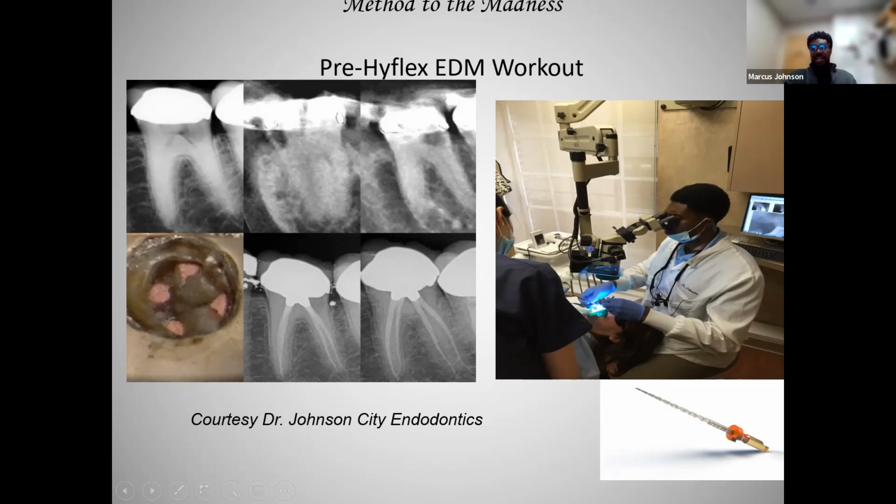Dentist was on board for right now. Go ahead and restore the tooth with alloy. And so what I did was complete those four canals, clean and shape, and then just a little amalgam plug and sealed it back up in hopes that at least it'll grant her some time until she can get back in and get that tooth properly evaluated and see what's the next step in terms of restoration.